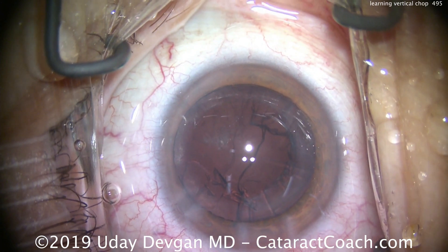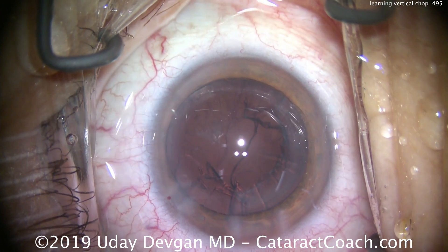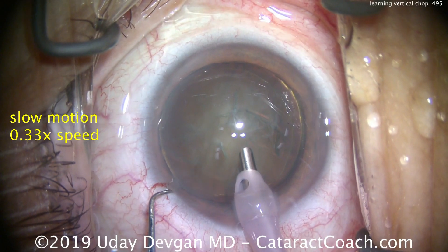The technique is to buzz in and hold the nucleus with the phaco probe, and then still within the confines of the capsulorhexis, place the chopper. Let's go at one-third speed here to break it down.